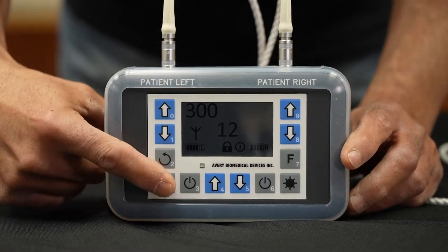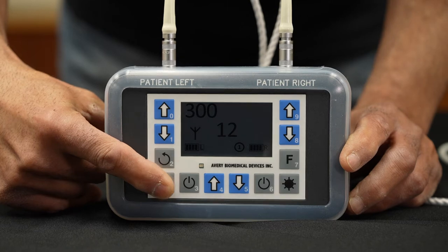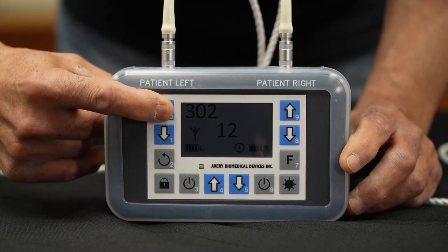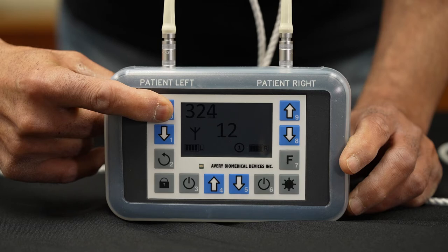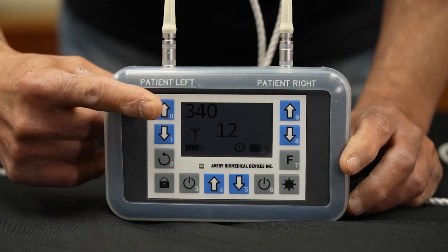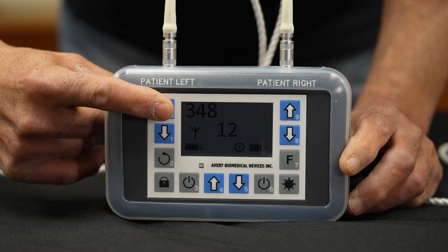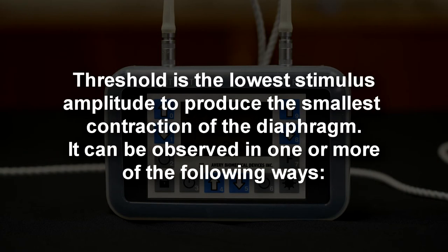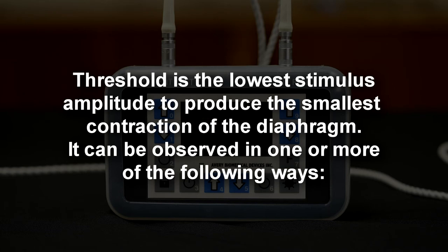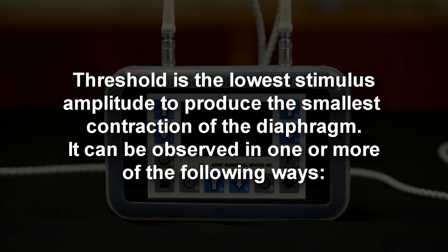To determine the threshold, starting at 300, slowly increase the amplitude by pressing the left up arrow key until the smallest diaphragm contraction is observed while the three-wave icon on the display is visible. Threshold is the lowest stimulus amplitude to produce the smallest contraction of the diaphragm. It can be observed in one or more of the following ways.